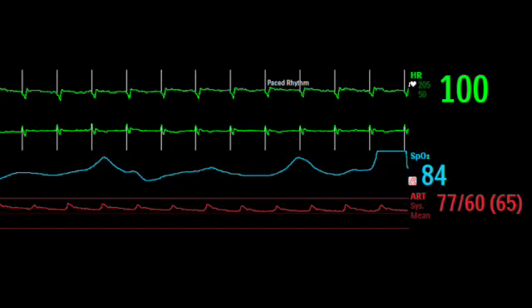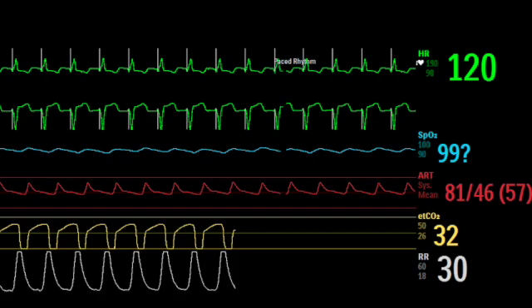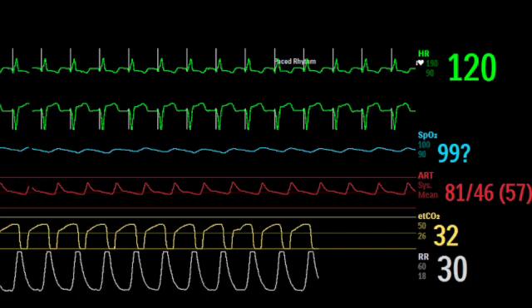Here's a patient being paced VVI at a rate of 100. Notice that there are no P waves before the QRSs. The pacemaker doesn't care about what the atrium is doing in VVI. And also see that the QRS is wide. Ventricular pace beats do not use the normal conduction systems in the heart used to spread the electrical signal quickly across the myocardium. So pace beats are wide and discoordinated, and that may also lead to pacing intolerance in a sick heart.